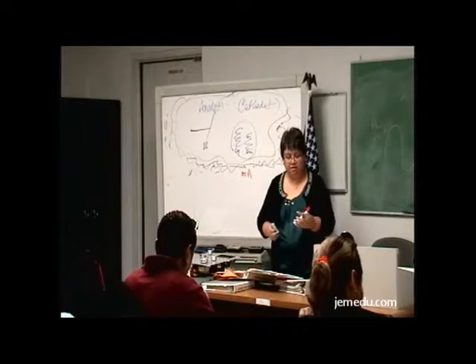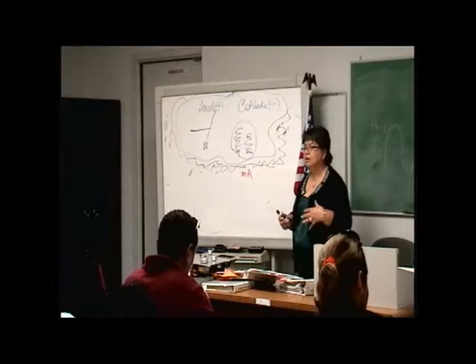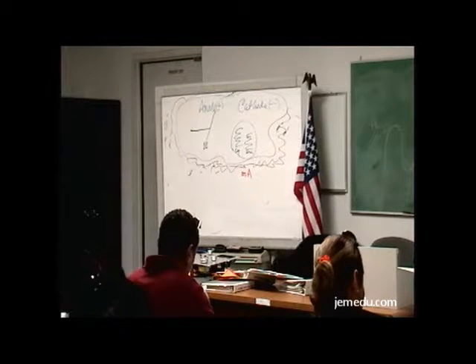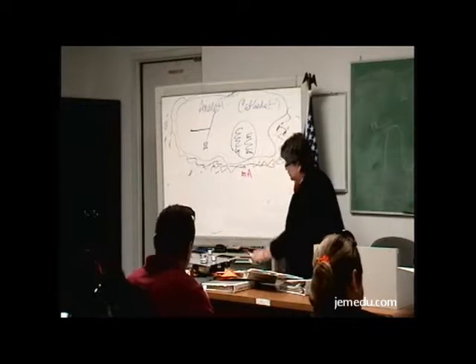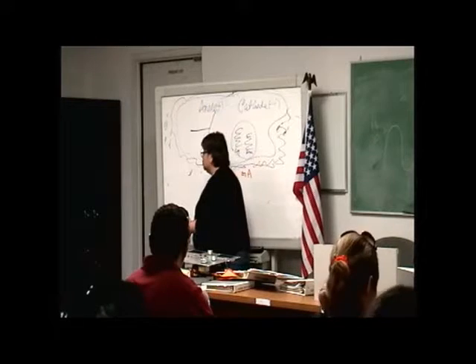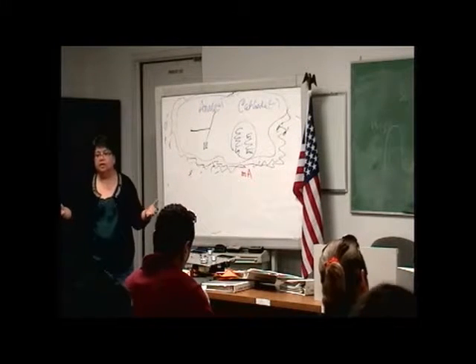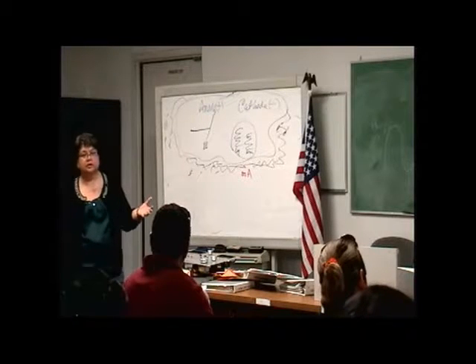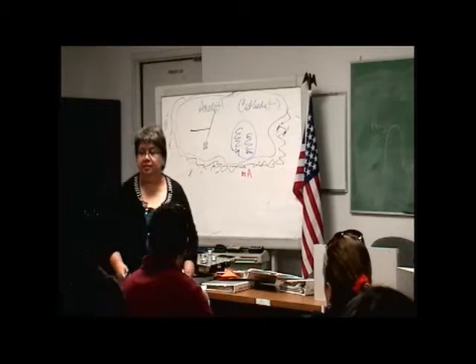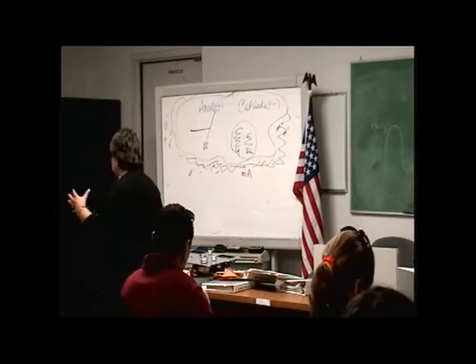Remember that tube is going to get hot when we produce X-rays. So that oil is going to help cool. Just like you put oil in your car to help it as a cooling agent as well. We do the same thing with this. So we're going to have oil around the tube. Now the tube with this oil, obviously we just can't have oil on the tube and it's suspended in air. We have to encase it in what? Plastic or metal? Metal. It's going to be in a metal housing.